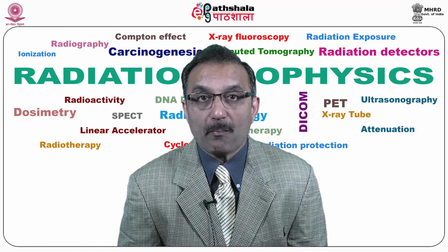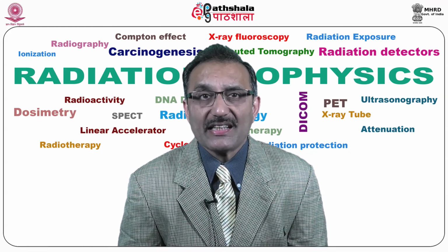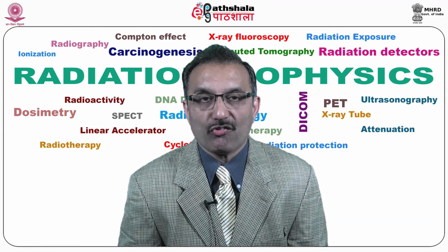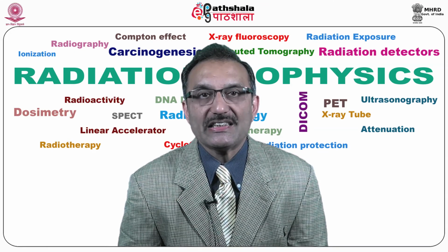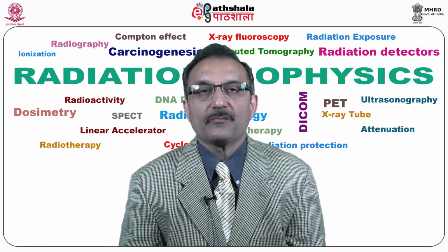PET must be done by a nuclear medicine physician who is specialized in nuclear medicine and has substantial experience with PET. Most large medical centers now have PET services available to their patients. Finally, the value of PET scan is enhanced when it is part of a larger diagnostic workup. This often entails comparison of the PET scan with other imaging studies such as CT or MRI.